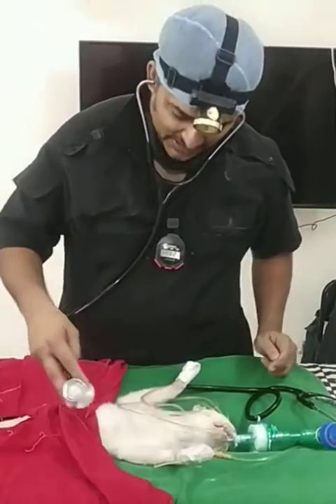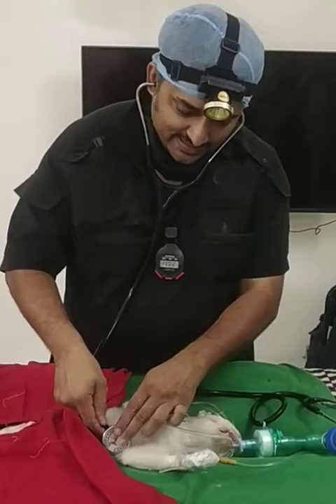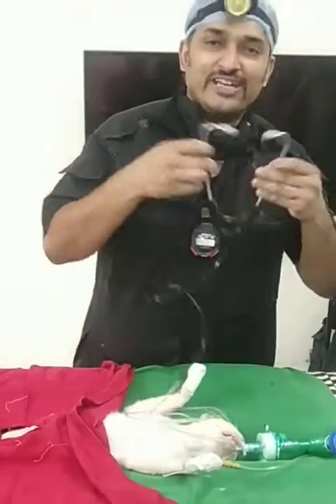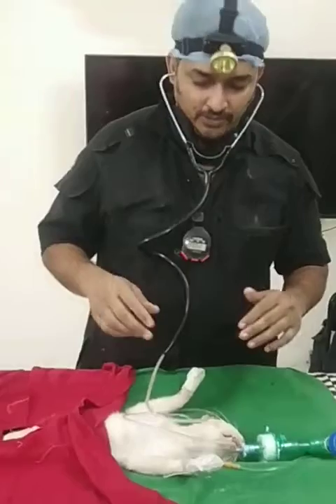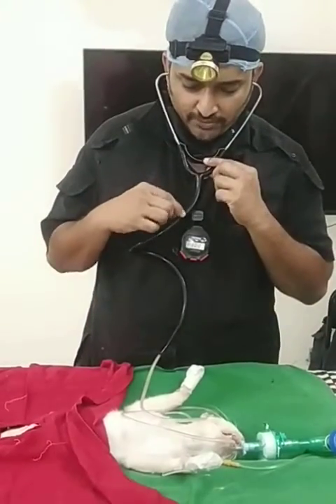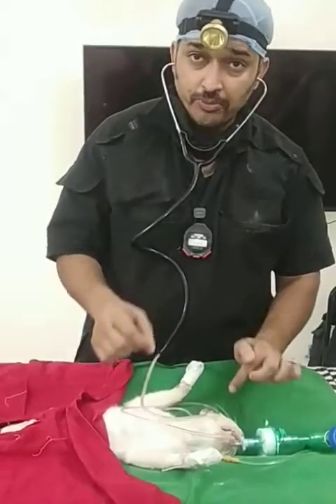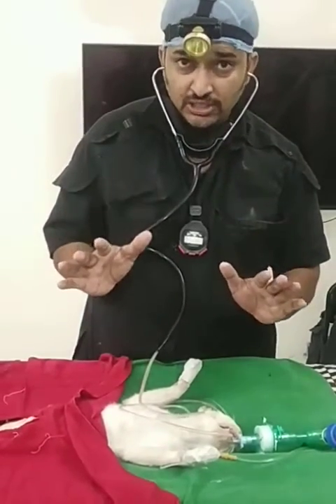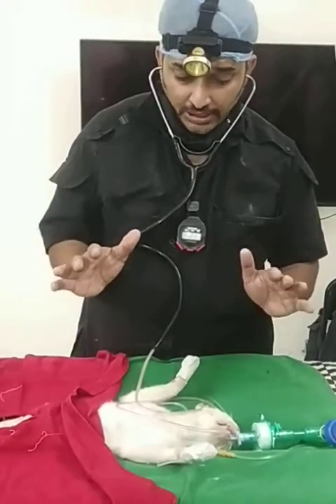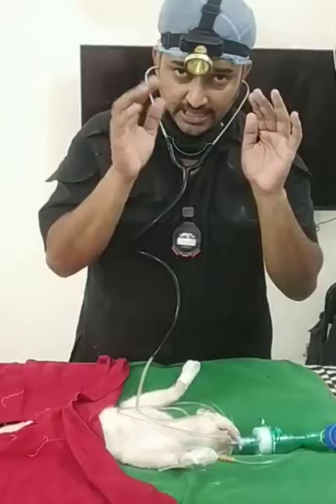Necessity is the mother of invention, and here we have our own esophageal stethoscope. I'm very happy to pass on the design — it's very simple. It's a basic stethoscope frame; I've removed the diaphragm, connected the Ryles tube, measured it, and duplicated it. This ensures anesthesia is adequate.